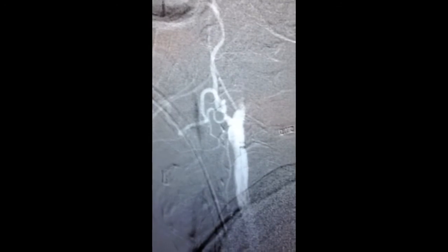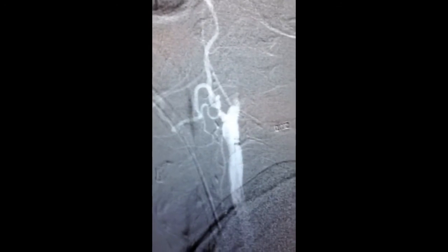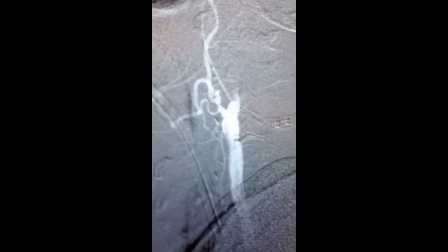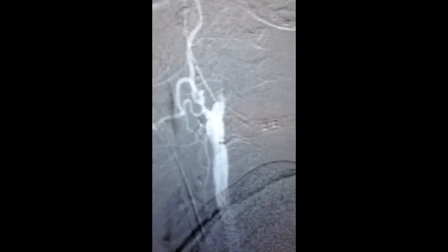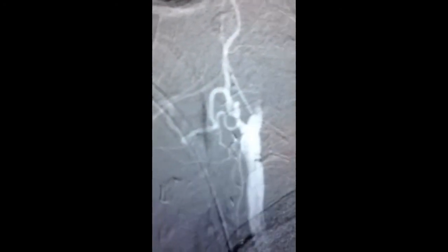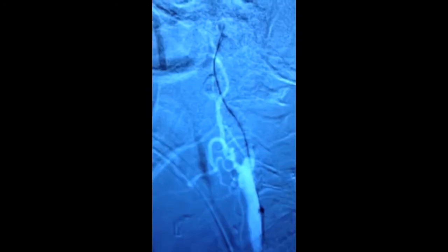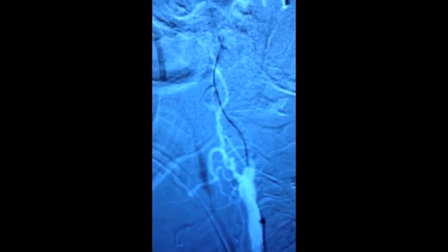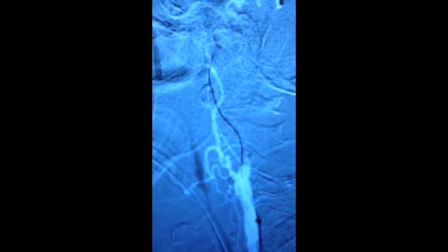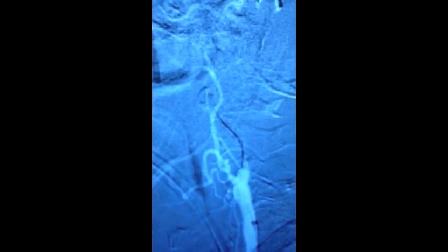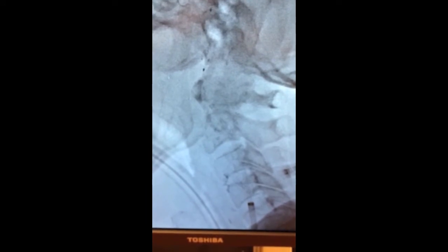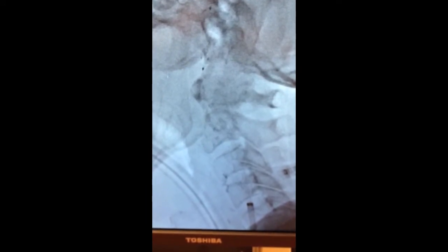Here we see an arteriogram of the cervical carotid artery showing an occluded internal carotid artery. This patient presented with a stroke. A wire has been placed across the occluded or blocked artery, and a large catheter has now been advanced over that wire.